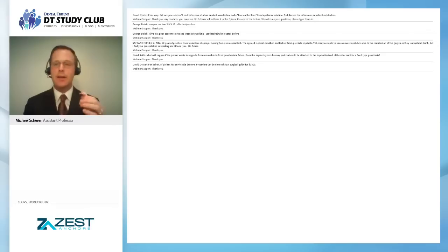And what we found is that, again, this is a topic for a different discussion, a different webinar, with the green mousse type of PVS impression, if we inject that into here, we want some show-through of it, because that ensures that the guide and the denture are down all the way. We can do our 2 scans, and that acts as the fiducial marker. That's pretty cool. So no gutta-percha, radiopaque PVS is your fiducial marker. Then the company can digitally stitch these 2 images together.